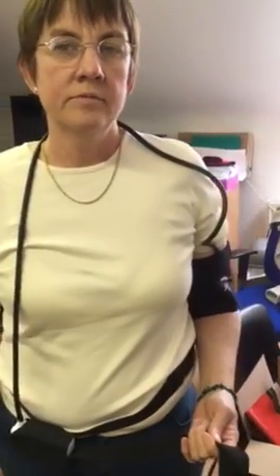And sometimes what some people do is place some tape here, just on the jersey, just to make sure that the wiring is kept secure so it doesn't fall and annoy the patient. The only other issue is it's probably best that people wear loose-fitting clothing so they can get them off. If somebody needs to remove it, obviously they can take the wiring around their head and remove their jersey.